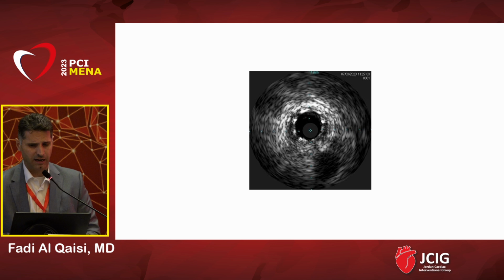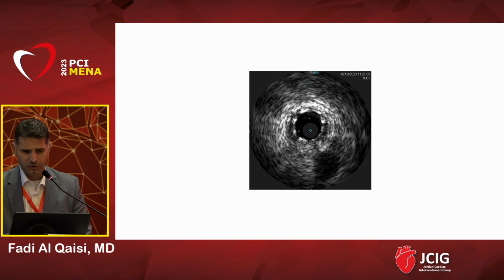This is the LAD IVUS. I will let it run. We started in the mid segment, and we are pulling back. You can appreciate the previous stents are not fully expanded. This is the previous stent. Then we are going to move to the ostial LAD into the left main. This is the ostial, and this is the left main. And I will show you the still images.